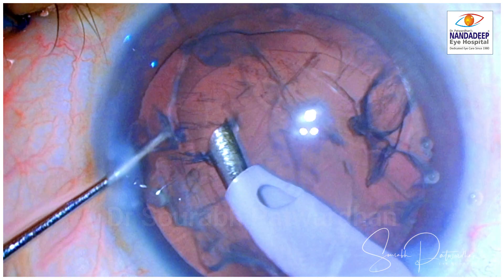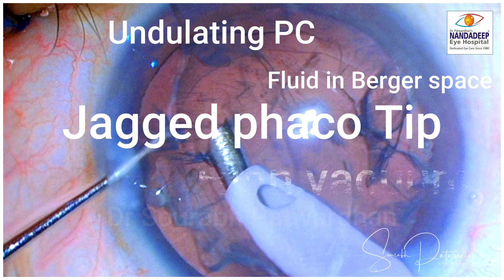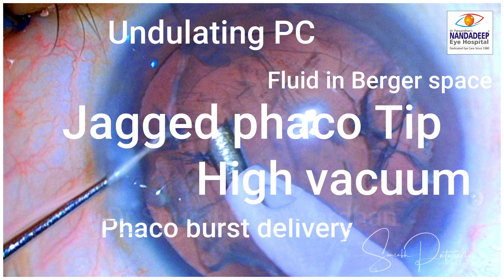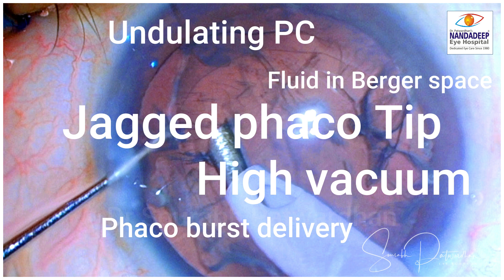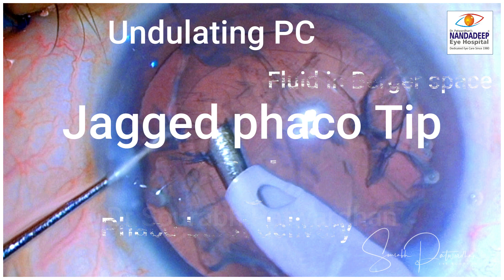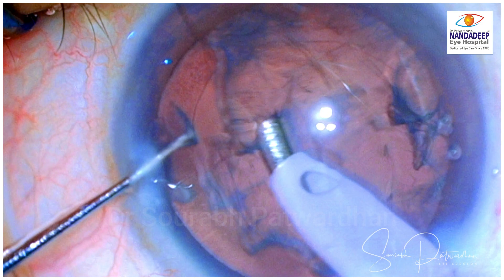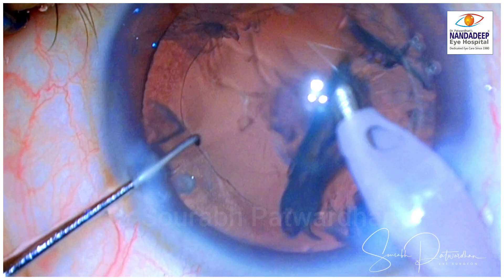Let's find out the causes behind it. The undulating PC and fluid in Berger space are common causes. A jagged FECO tip increases the chance of tear of the posterior capsule. Also, using high vacuum and unnecessary FECO bursts during epinucleus removal can also pierce through the posterior capsule. In this particular case, I think the undulating PC and that jagged FECO tip may have touched the posterior capsule and caused this PC rupture.